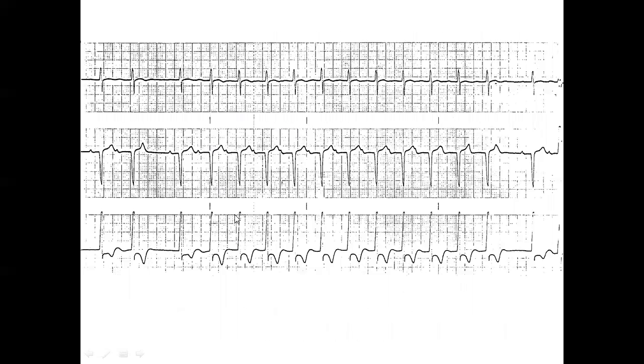We have a 3-channel rhythm strip. Useless, but this is useful. So don't waste time with the useless leads, but go find which lead is most useful, then spend the time on it. Not on this one, not on this one. You don't make anything out of it. You don't make anything out of it. But here you see the P clearly. Isn't it amazing? Certain leads are so useful, other leads are useless.